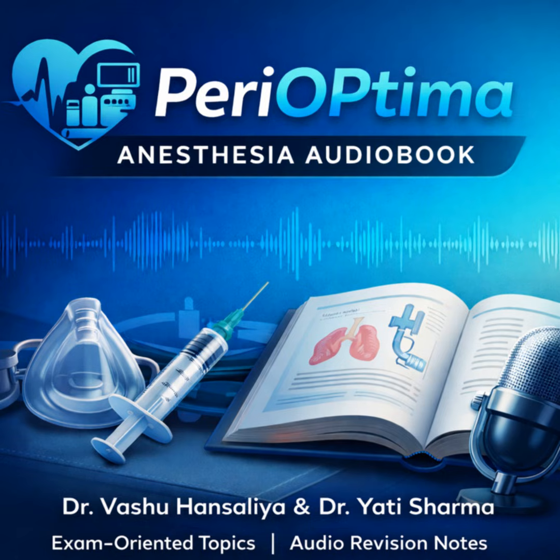And in the high-stress environment of an emergency airway, the first attempt needs to be the best attempt. Visualization is everything. This is why VL is being integrated more and more into emergency algorithms. It maximizes your chance of getting a good view on that first critical look. And of course, having all your backup gear, suction, a bougie, a smaller tube, ready is non-negotiable.